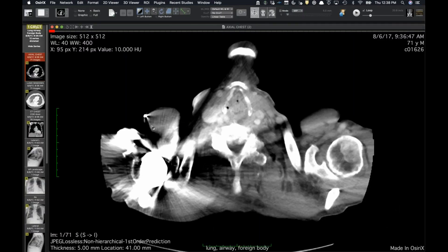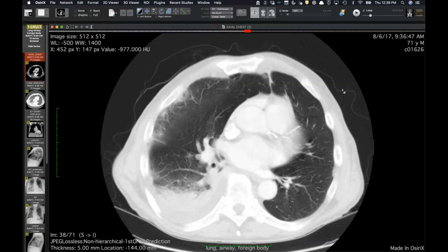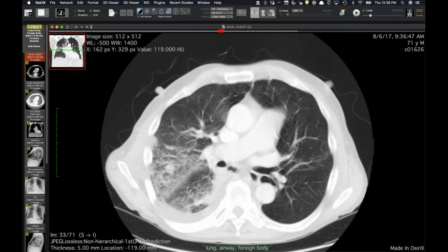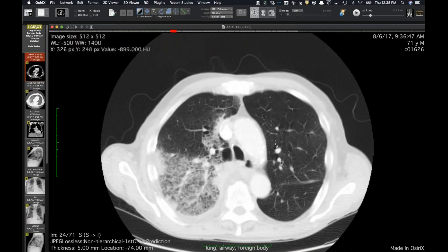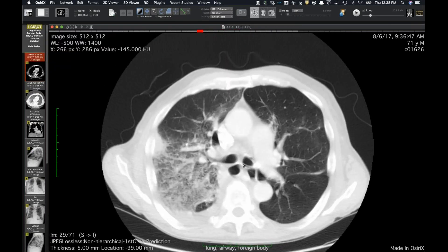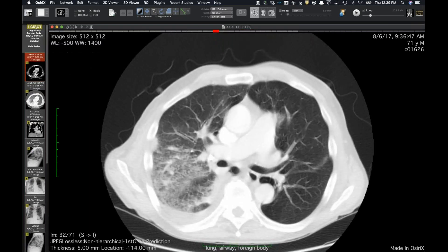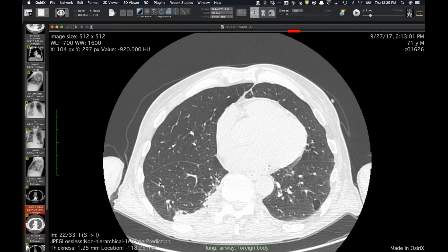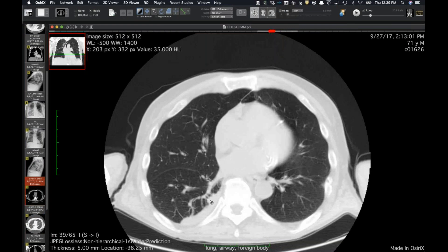This next case is interesting, not cancer, but related. This is a guy admitted elsewhere for what looks like pneumonia, maybe aspiration, with possibly some component of edema and an effusion. I'll direct your attention to the right-sided airways — they're fine. He gets better, then gets another CT a month and a half later because he's still having some symptoms.